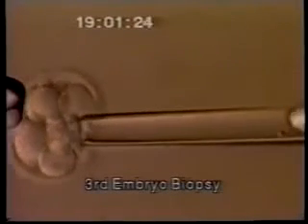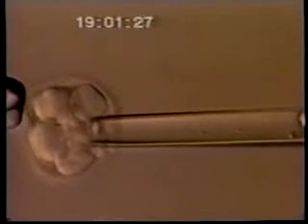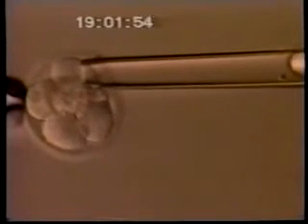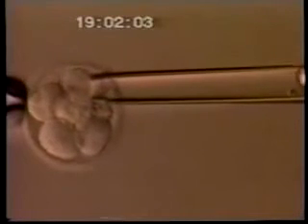This is the embryo biopsy pipette. Now, in this embryo biopsy, you're going to see it's somewhat more difficult to tease the cells out, because this embryo is advanced several hours farther along than the previous two you saw, and therefore these 8 cells are no longer functioning so much like independent units, but have begun to stick together more and are actually functioning more as an entity, as an 8-cell entity that has 8 separate cells. It's at this moment of compaction that you can see well demonstrated here that not only is it more difficult to do the biopsy, but possibly there may be the beginning of differentiation of the individual cells of the embryo.